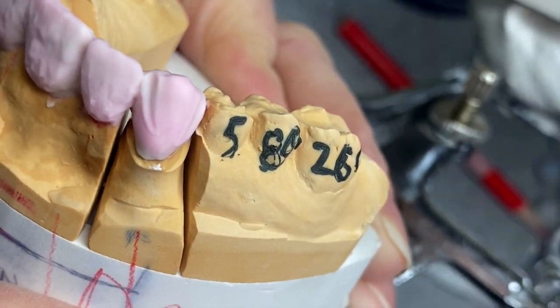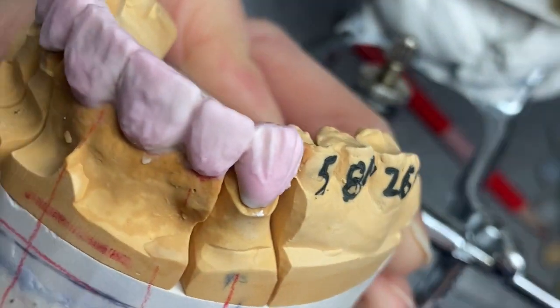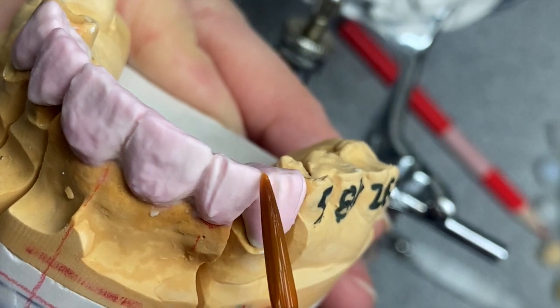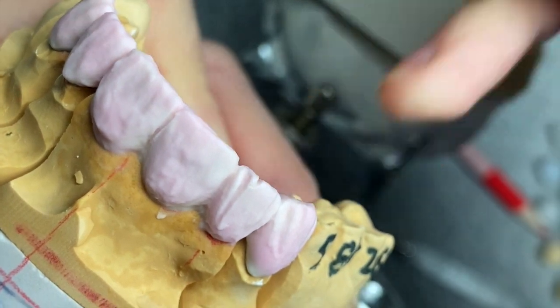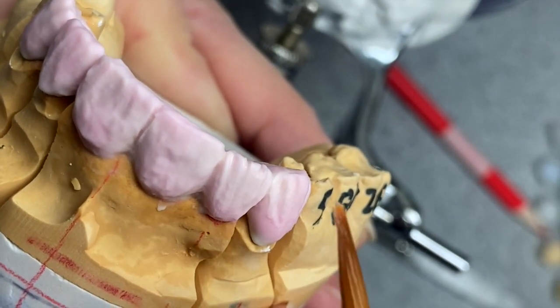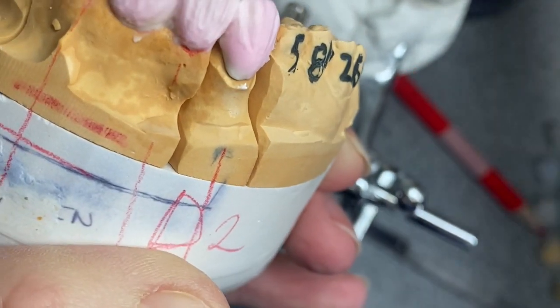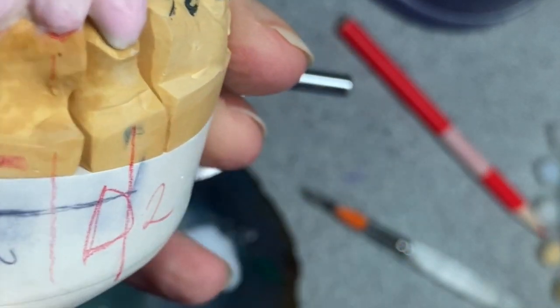This is going to be a simple cut back. I'm only going to scoop out a little bit on the mesial and distal part of the crown, and then divide the tip of the crown in three. Okay, now clear the porcelain.